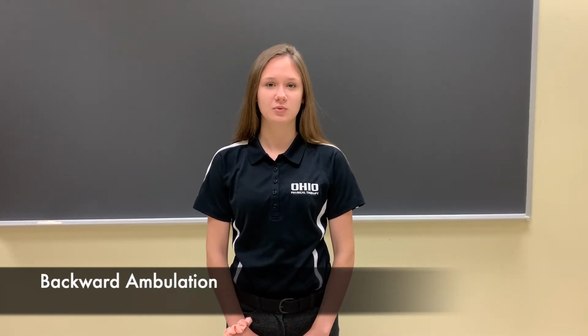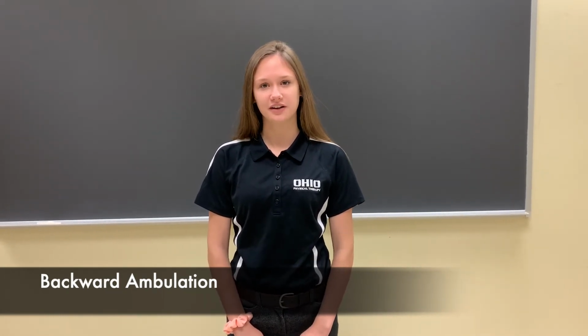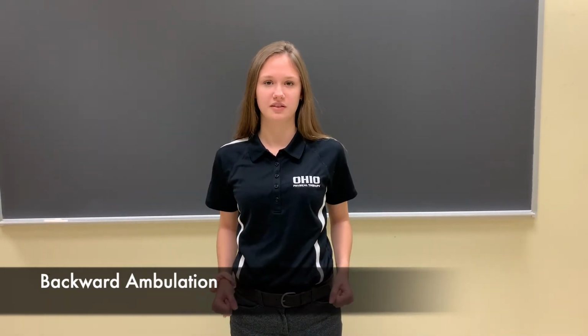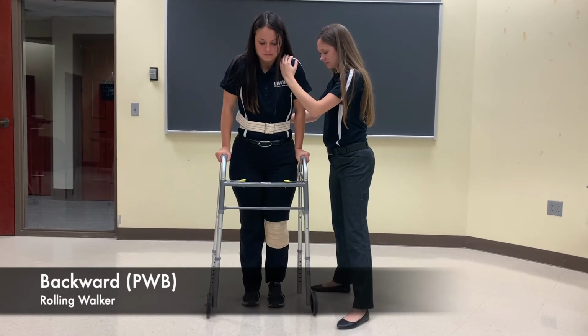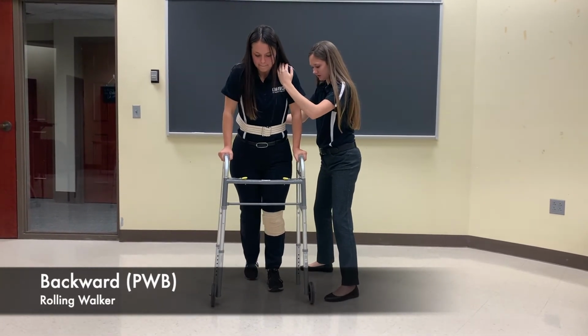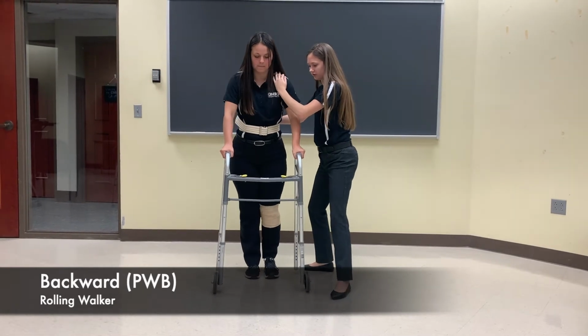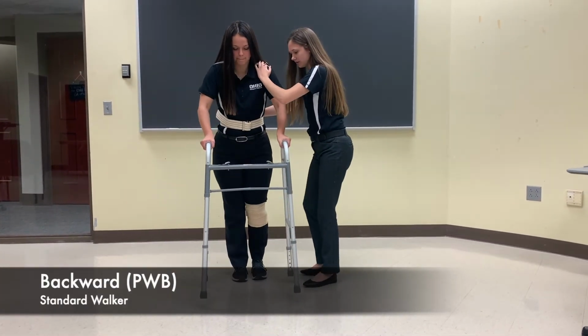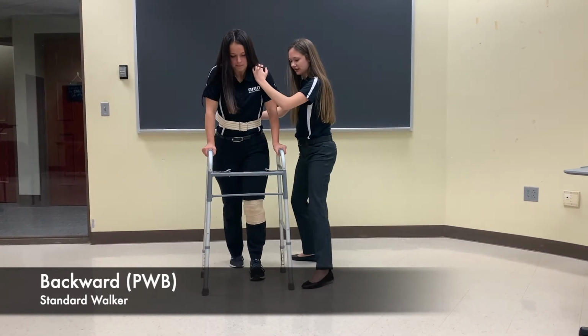For backwards ambulation in partial and non-weight-bearing scenarios, the patient will begin by moving the unaffected limb one pace backward and then bringing the walker back to meet them. Good leg, bad leg, walker, good leg, bad leg, walker.